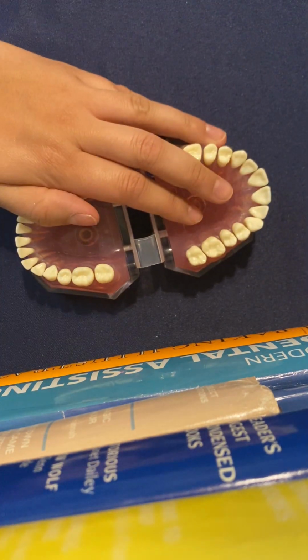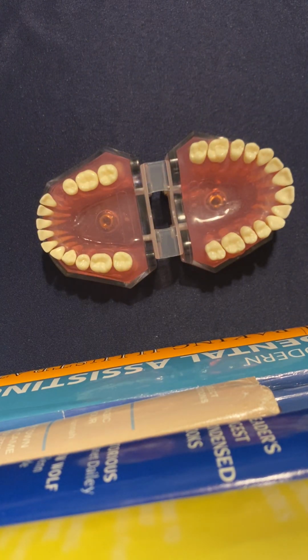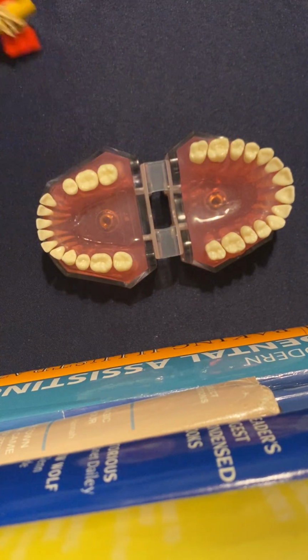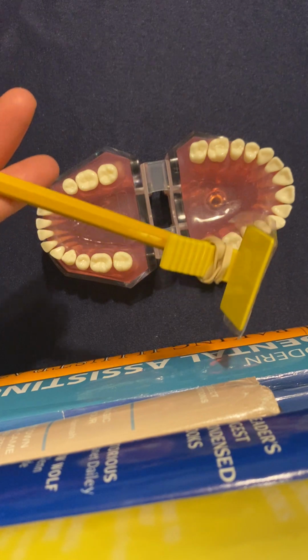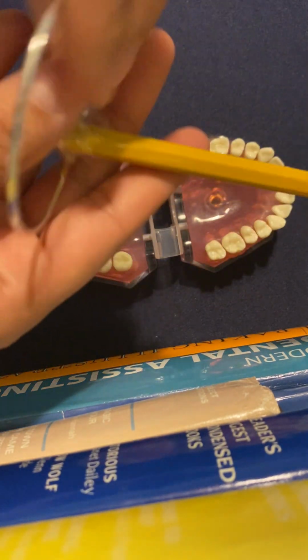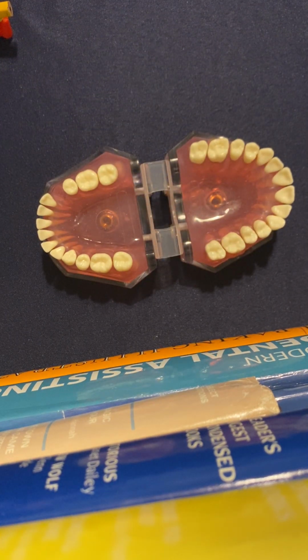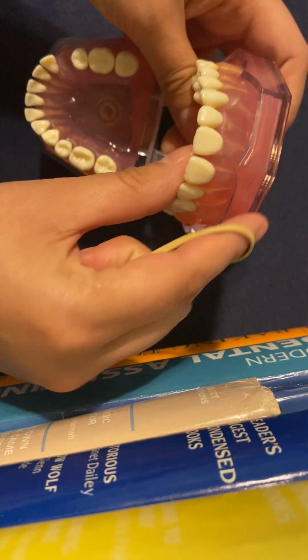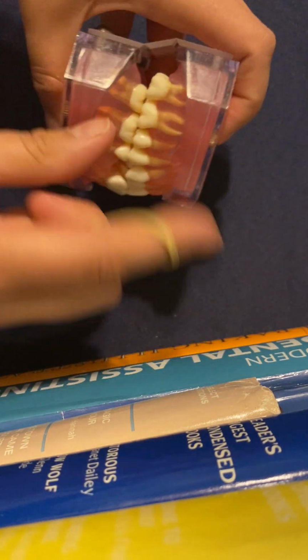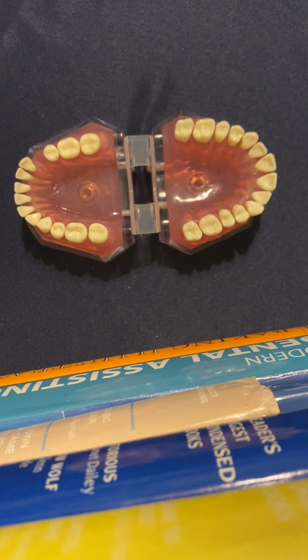All right. Number 15. Ooh, we're getting on to my favorite ones. I like these because they don't hurt the patient as much, and I think they're a little bit easier to take. So say goodbye to the posterior bite tabs and say hello to the bitewings. The other ones were to see up in here mostly, to see the roots and stuff. Bitewings is mostly you want to see in between the teeth, and how they line up. I like them. But obviously the dentist decides what pictures they need.